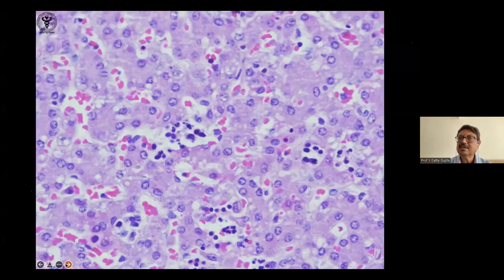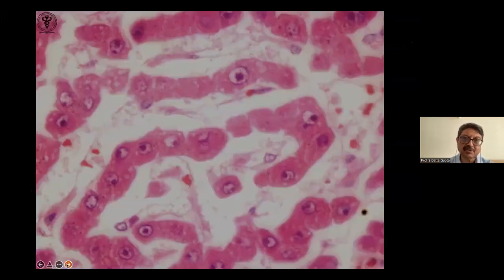The other thing, you hardly get inflammatory cells in the portal tract. You can get a few inflammatory cells normally in the portal tract, and in children, you can get extramedullary hemopoiesis. These are normoblasts and megakaryocytes within the sinusoid. This is normal. The space of Disse cannot be seen. This is one instance in autopsy liver, because of autolysis.